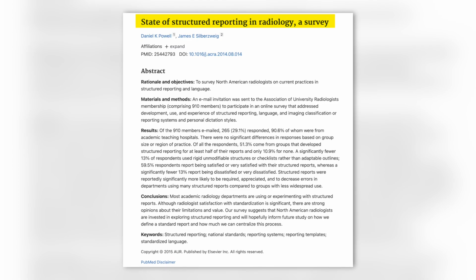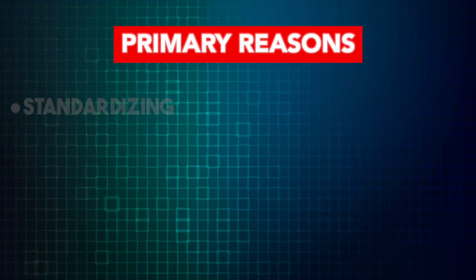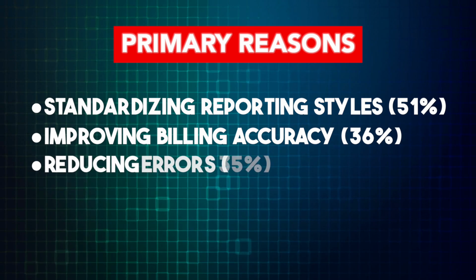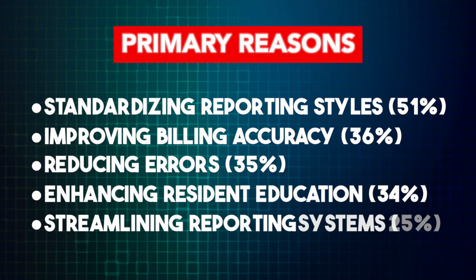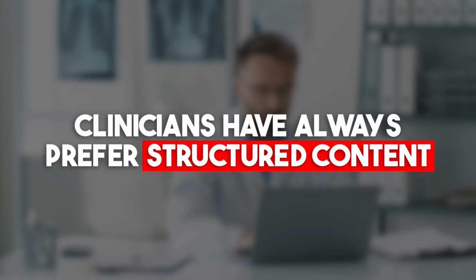The need to add structure to reporting was identified over 100 years ago by radiologists. Today, surveys identify the primary reasons for going down structured reporting implementations. Those reasons include standardized reporting styles, improved billing accuracy, reducing errors, enhancing resident education, and streamlining reporting systems. Interestingly, though radiologists have mixed opinions about implementing structured reporting, clinicians have always preferred the structured content.